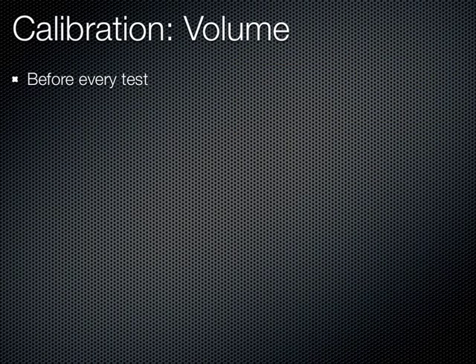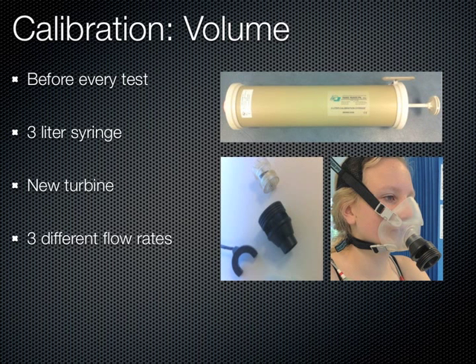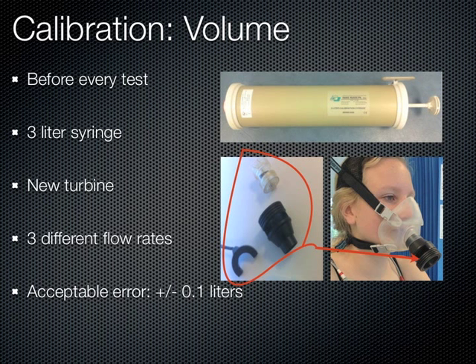We also calibrate flow volume before each test using a 3-liter syringe and a new turbine. The syringes are externally calibrated to ensure that they represent 3 liters of air. We put air through the syringe at three different flow rates: slow at 0.5 liters per second, then 1 liter per second, and finally at 3 liters per second. This shows the flow rate volume over a range of minute ventilations to mirror the different breaths the patient takes over the course of the test. The syringe must be pumped three successful times for the measurement to be taken. We then check that the values are within a 0.1 range of error and transfer the measurements to the calibration log.